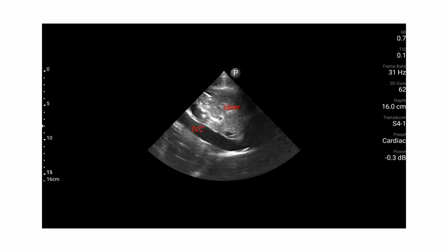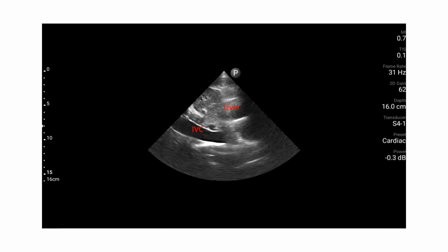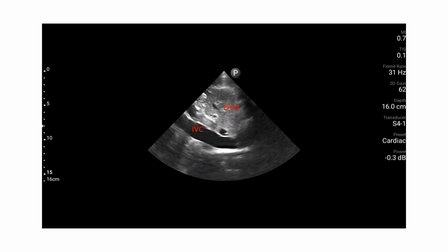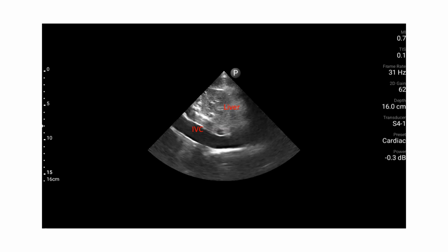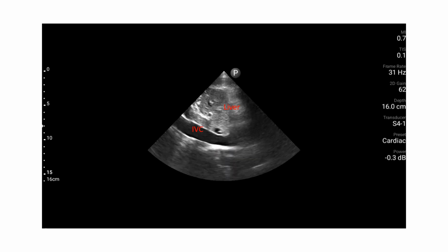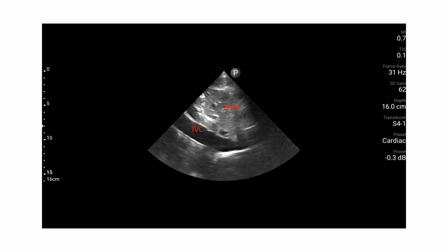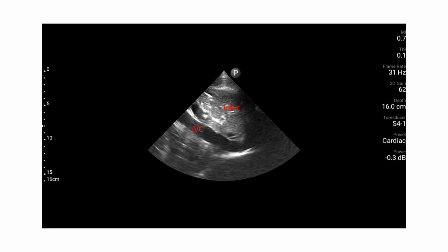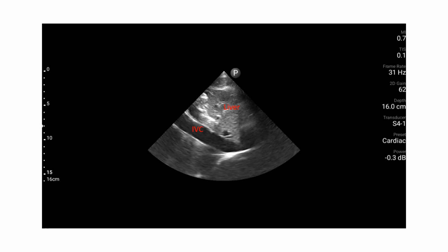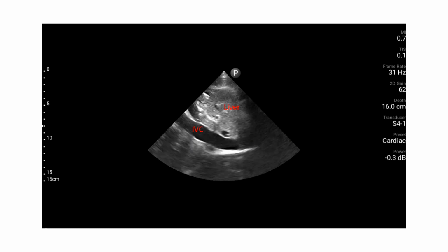But again, how do I use this for a quick assessment? Basically you want to look at it and you want to see, is it normal size or not? And I do mean that visually. So does it look normal in size? And you can kind of gauge. You have your depth gauges on the left there. It goes down, right, the inferior part of that is 15 centimeters. So you can gauge a qualitative assessment of how big that IVC is, and then just, is it collapsing on you or not?